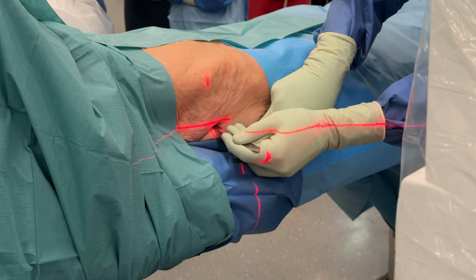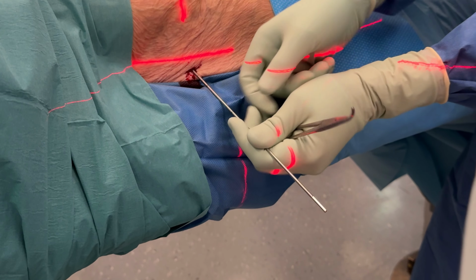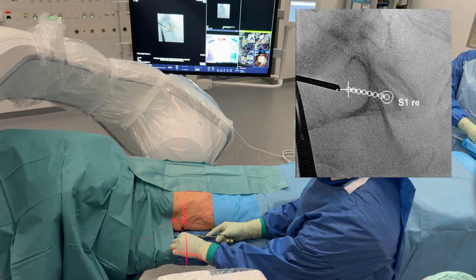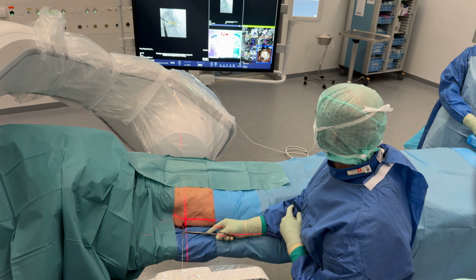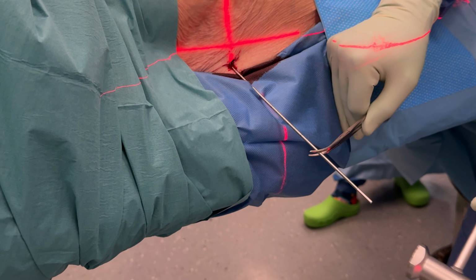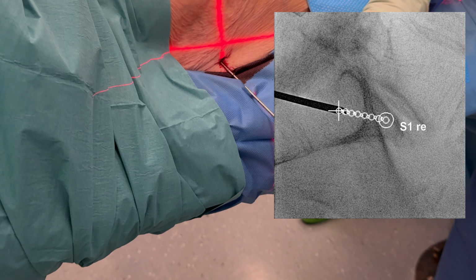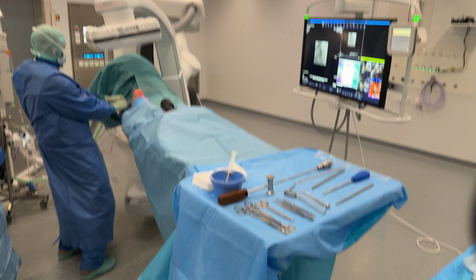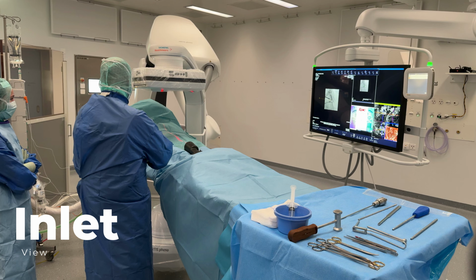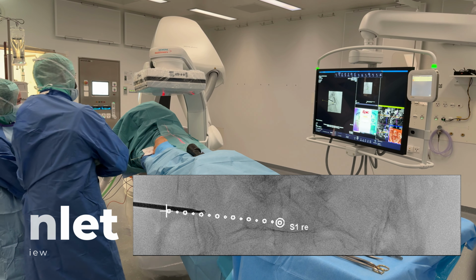A stab incision is made and a 2.8 mm K-wire introduced onto the bone. The position of the K-wire is checked and corrected on the repeated X-ray controls in the lateral view. Once the optimal entry point is found, the K-wire is advanced into the bone with slight hammer blows. Then the C-arm is moved to the previously defined personalized inlet and outlet views to check the direction of the K-wire. Adaptations may be made.